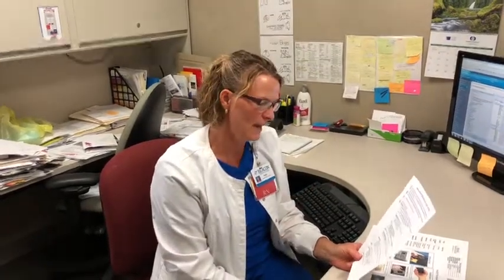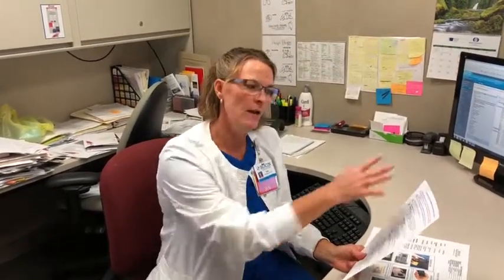If the patient is admitted to the hospital, you need to contact the nursing supervisors and your friendly diabetes educators, and our phone numbers are on the SBAR that I'm sending out. Let us know the presence of the pump so that we will follow up from the inpatient side. And if you're boarding a patient awaiting a bed, you need to contact the nursing supervisor so then they can determine when the SBAR and the process changes from ER to inpatient. If you have any questions, please let us know.